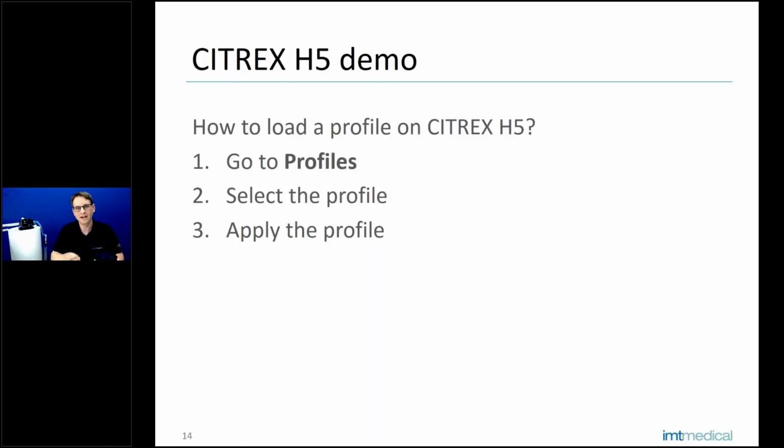So to do that, either we can connect this micro SD card to our computer, which is what I will do here to demonstrate it, or we can also connect the CITREX via USB cable to our computer. Then it will ask us on CITREX if we want to use it as mass storage device. If we then select yes, we will see on our computer, if we start the file browser, the files which are on our built-in SD memory card.